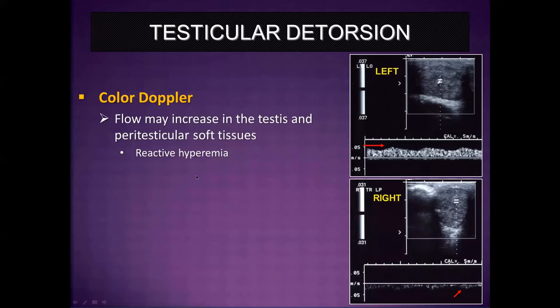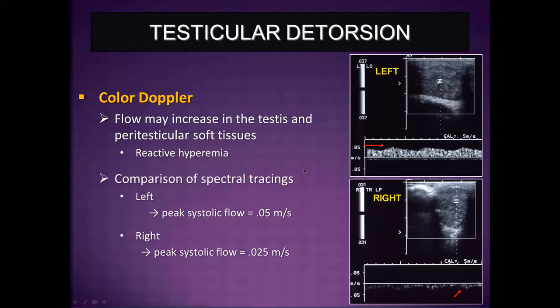For testicular detorsion, if you look at the spectral waveform analysis, patients who have detorsed may demonstrate increased flow in the testicle and peritesticular soft tissues secondary to reactive hyperemia. In one patient who had resolved left testicular pain by the time of ultrasound, the peak systolic flow on the symptomatic left side was 0.05 meters per second, compared to 0.025 on the asymptomatic right. This assumes Doppler settings are not changed between tracings, as that could falsely alter the appearance of peak systolic flow.